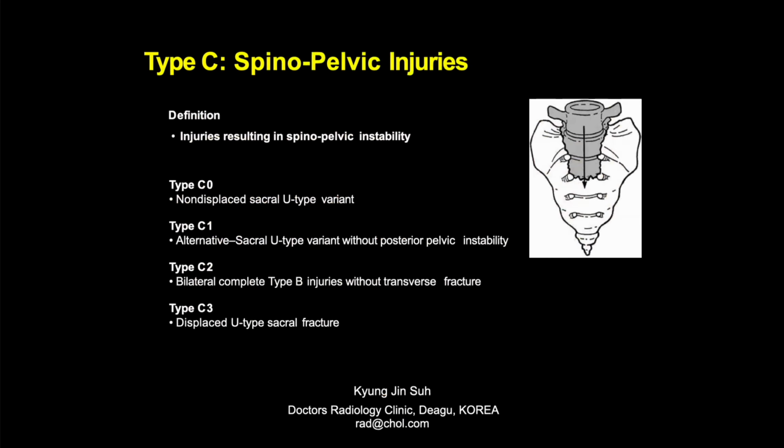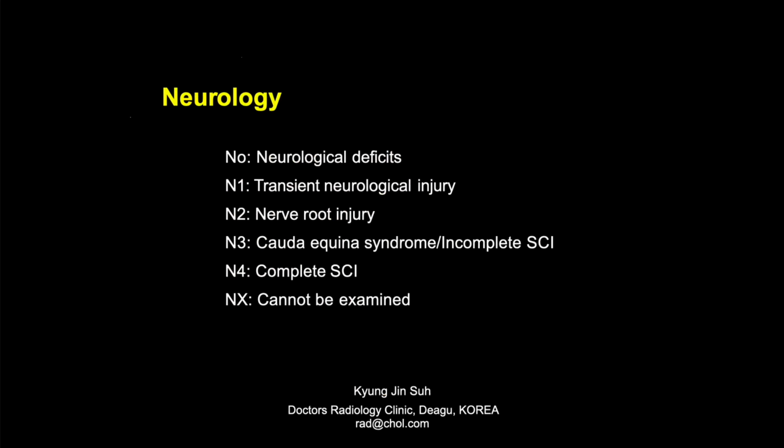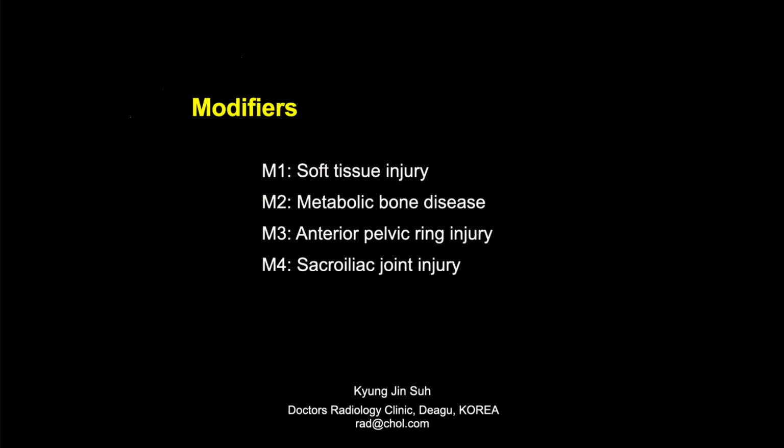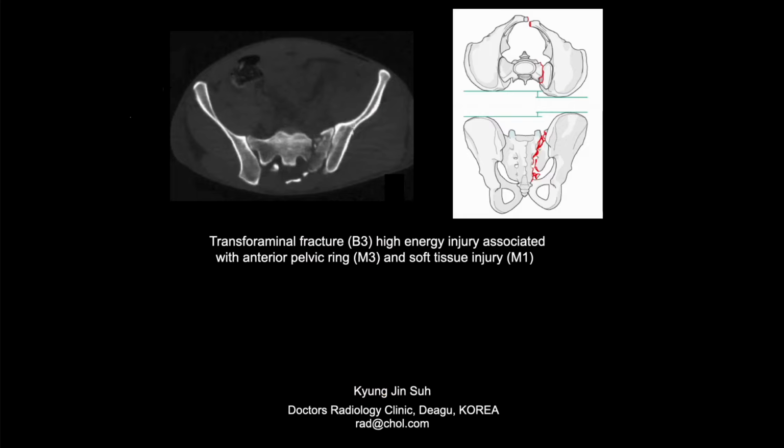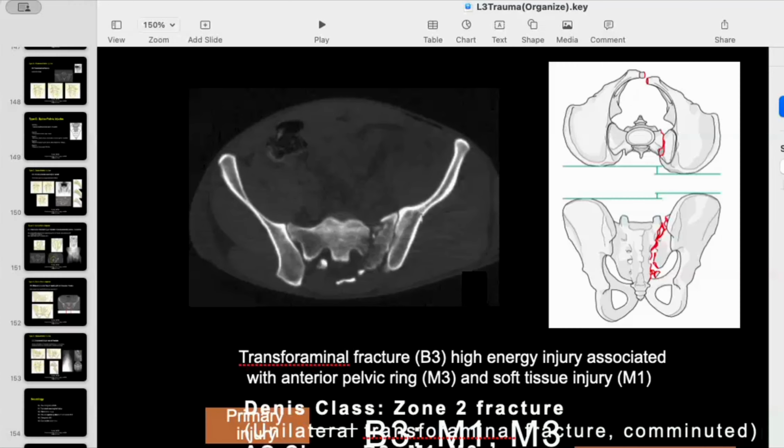Okay. And obviously then the clinician will correlate the findings and the location of the fractures with the neurologic deficits and then determine where to go. So these are more clinically relevant grading systems. And then you can also look for pelvic ring instability. And there are grading systems that I don't think we need to go through. Okay, so that's kind of trauma to the spine.